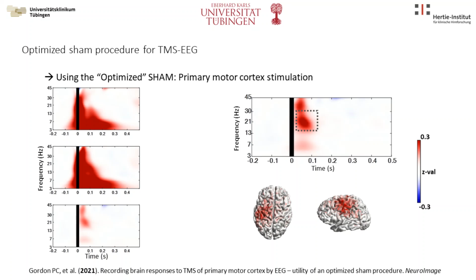We can also apply the same idea to TMS-induced oscillations, where the sensory inputs are also responsible for a broadband power increase after the pulse. The subtraction of the response from the sham reveals the specific effect of the primary motor cortex direct stimulation, which is an early beta increase in the ipsilateral sensory motor cortex.